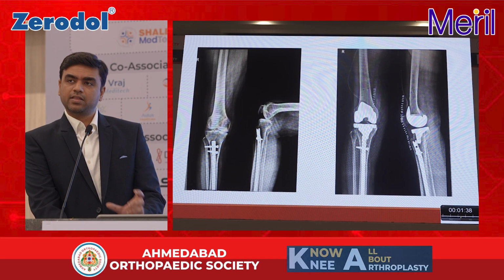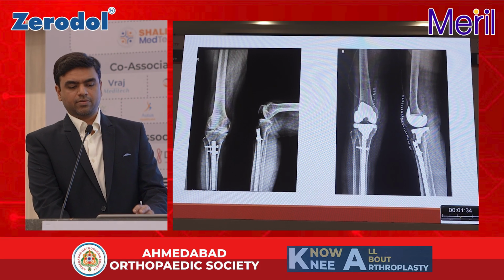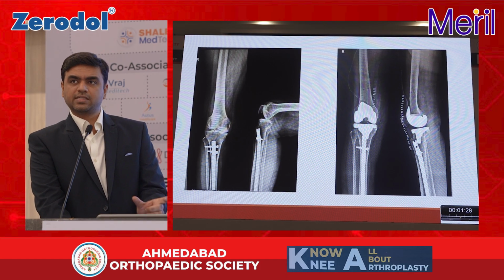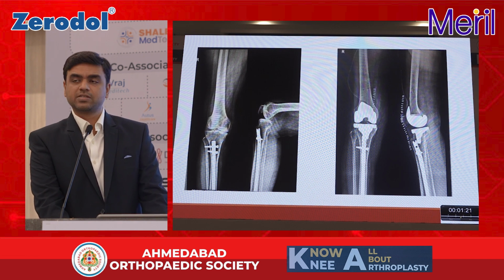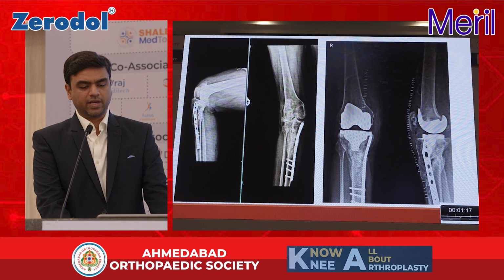Same along with the femur, we can do with the tibia rod also. You can identify the type of slope you can do and control it in a way without disturbing the tibial nail, and you can position your tibia like medializing, lateralizing, undersizing, correct sizing as per the requirement based on the previous hardware, and you can get away just like in normal primary cases.